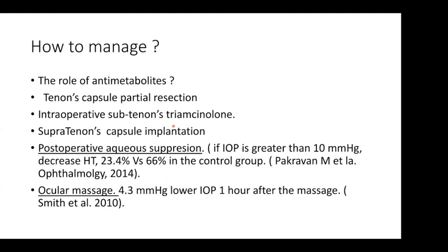How to manage the hypertensive phase? Now you have put an implant and the patient comes after 2 months with pressure elevation. Definitely you can feel a bit frustrated because it's a big surgery, and sometimes a costly surgery as well. So how to manage this? A lot of debates around the role of the anti-metabolites. We know they don't have anything to do with the valve. Again, some studies suggested it might have something to do with this hypertensive phase.